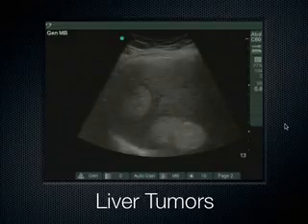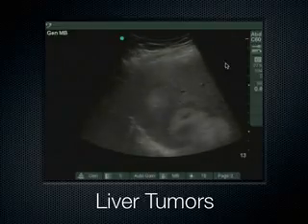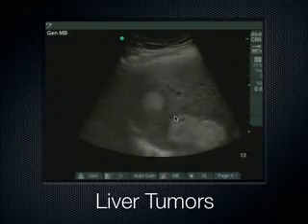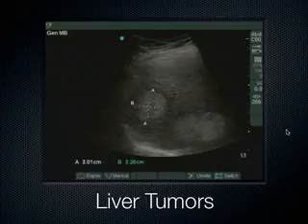We'll talk a lot more about that next year, but I wanted to bring this up right away so you can see that this liver doesn't have this nice isoechoic homogeneous texture. Rather, it has these hyperechoic areas that really jump off the screen at you.